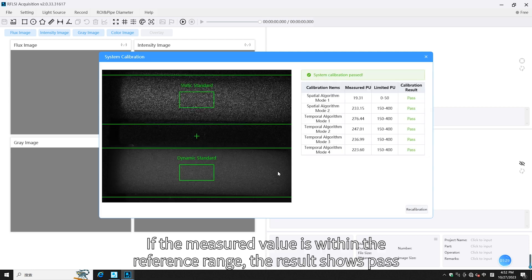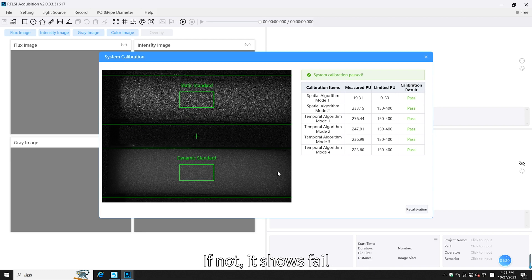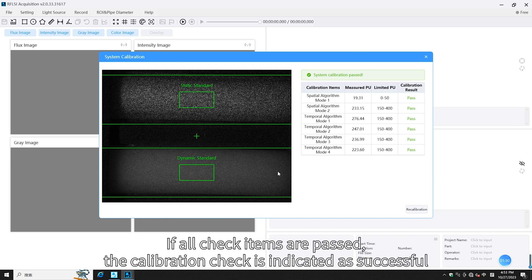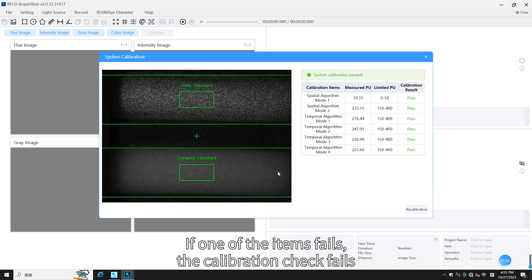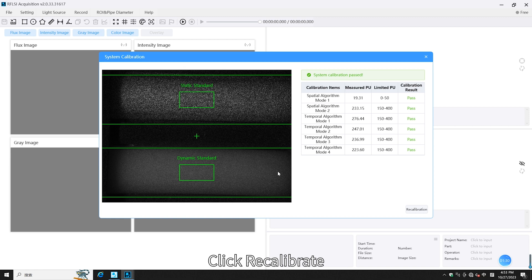If the measured value is within the reference range, the result shows Pass; if not, it shows Fail. If all check items pass, the calibration check is indicated as successful. If one item fails, the calibration check fails; click Recalibrate.